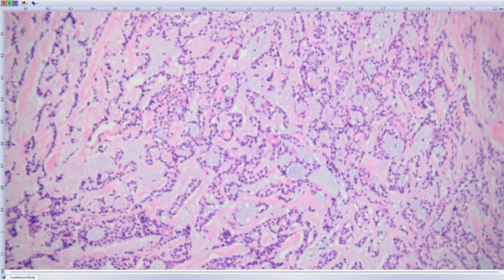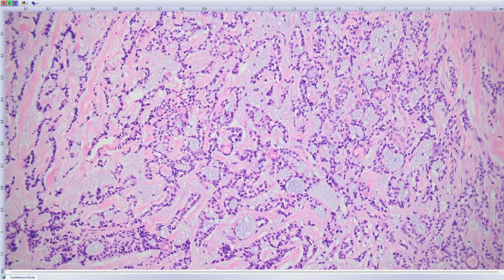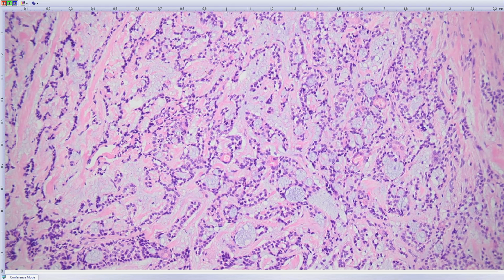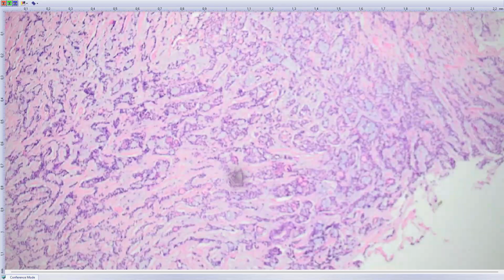At the first moment, I was enthusiastic about whether it is this recently described salivary gland carcinoma called microsecretory adenocarcinoma. But a very important differential diagnosis is, of course, adenoid cystic carcinoma, a very classical, very common lesion.